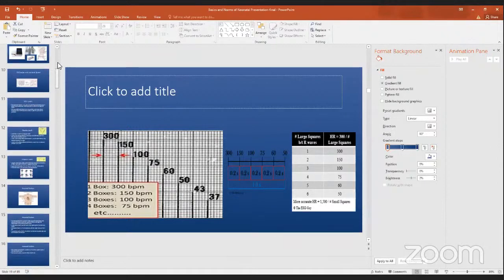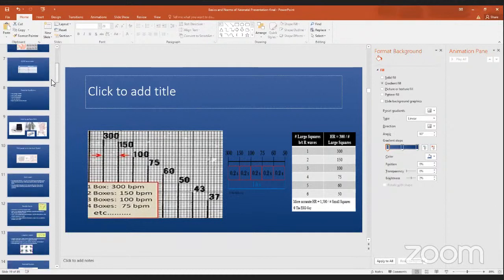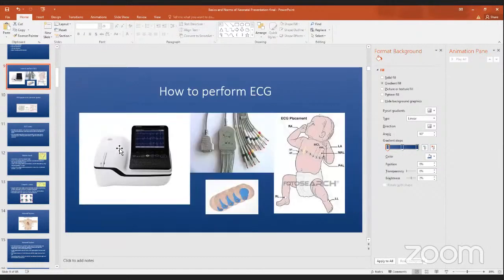In contrast to adults, there is something which holds the limbs, with metal attachments that transfer voltage. Yeah, but obviously those are very difficult to put on the little ones, the neonates. So you have to use really smaller electrodes.